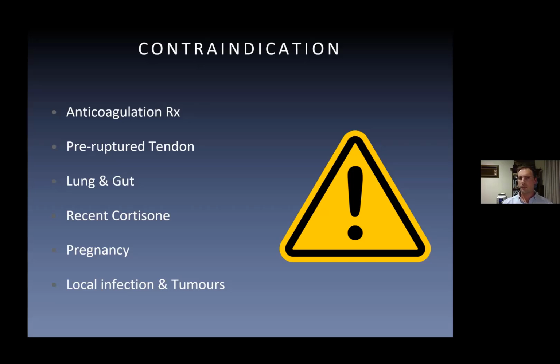I'm always starting at a very low intensity. And this is very different if I'm dealing with someone who's in their 40s, who's on low-dose aspirin, compared to somebody who's in their 80s, who's on warfarin. Completely different in terms of that. So anticoagulation therapy is a contraindication.